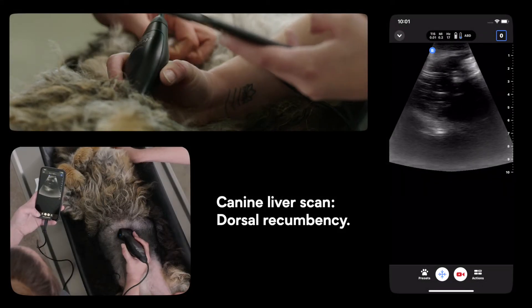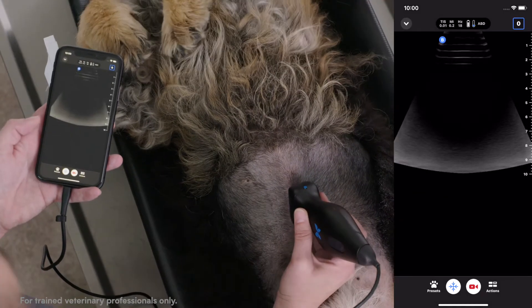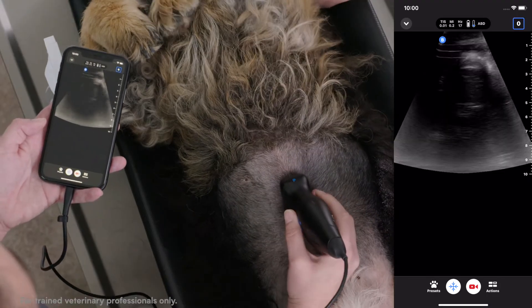To scan a liver in dorsal recumbency, we first start by selecting the abdominal preset and then place our probe sub-xiphoid with our cranial indicator pointing towards the patient's head.